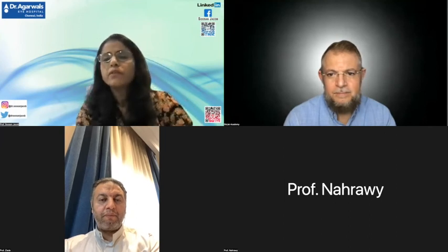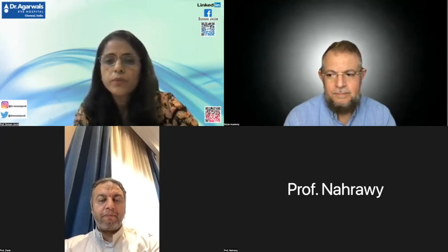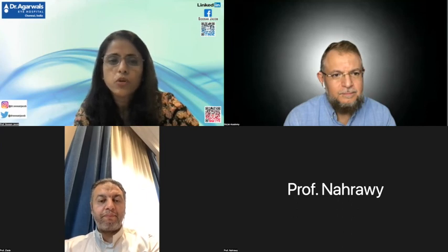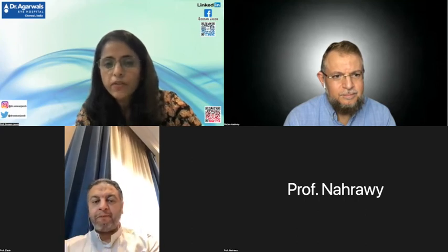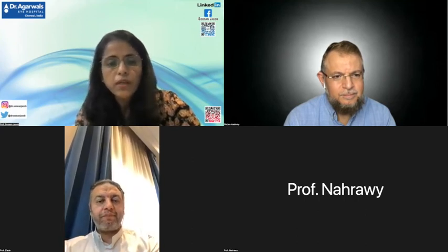Thank you very much. Now another question: whether we have to do corneal cross-linking with CAIRS in ages older than 30 years. Whether it should be combined with CAIRS or not would just depend on whether you think the patient is progressive or not. If you think it's progressive, it's always better to combine with cross-linking. If you think it's non-progressive, then you don't necessarily need to. So your decision will be based on that. Also, some people prefer to do CAIRS, wait for some time and then do cross-linking. I prefer to do it simultaneously because I like to finish my surgical procedures together.